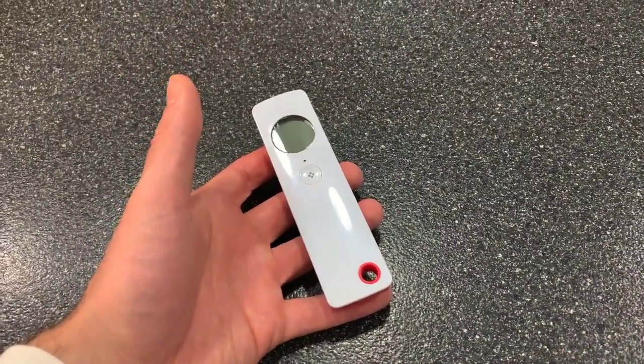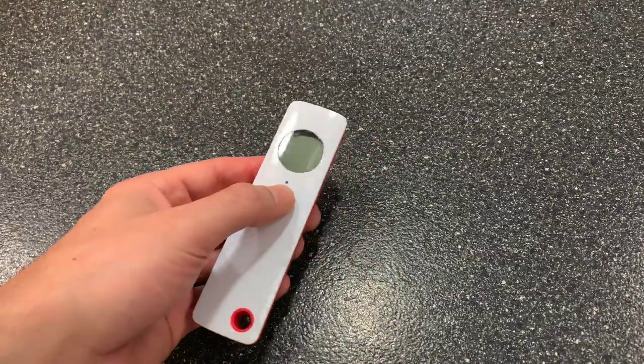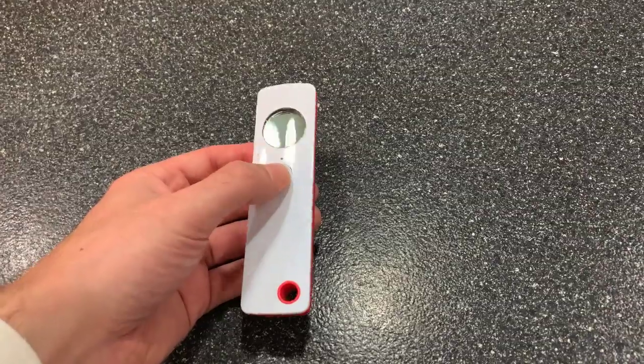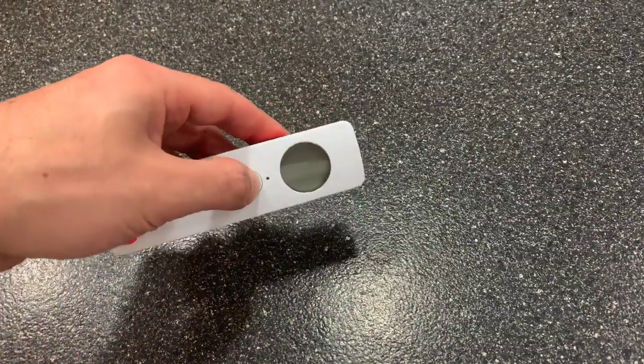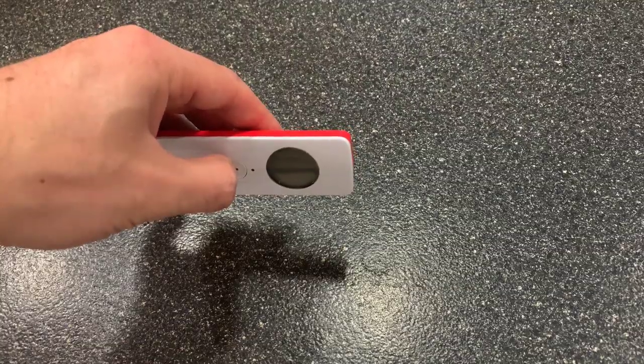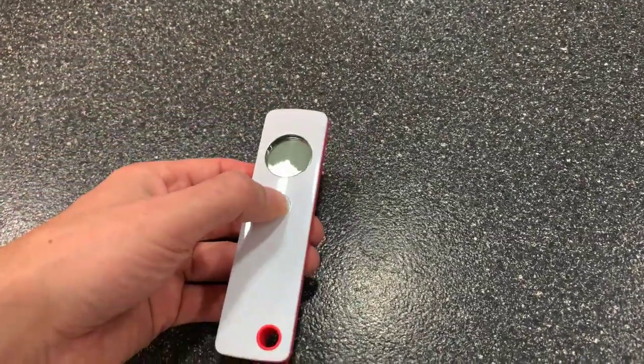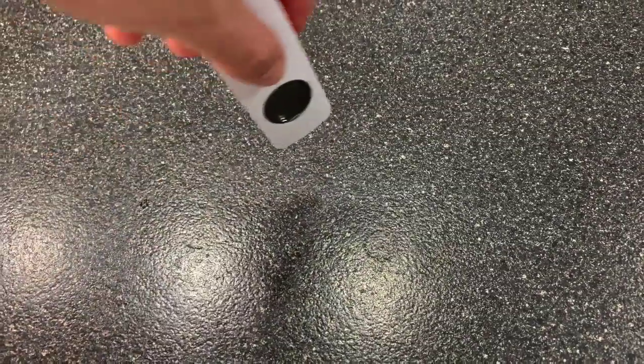Because first of all, it's instant. And second of all, it's healthy — you don't actually need to touch the skin. It works about an inch away from the forehead, so it's not like you're actually touching.